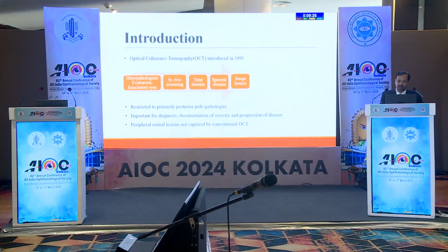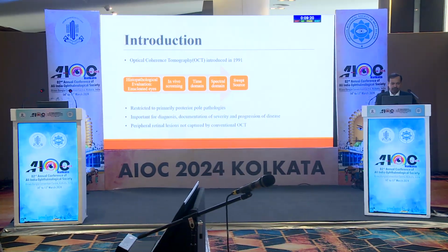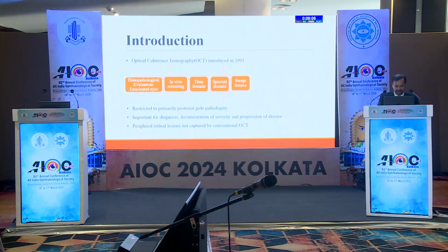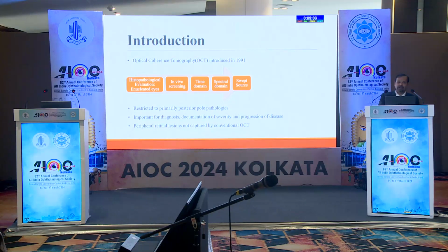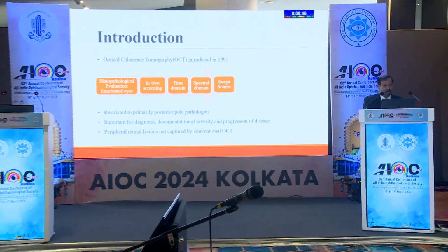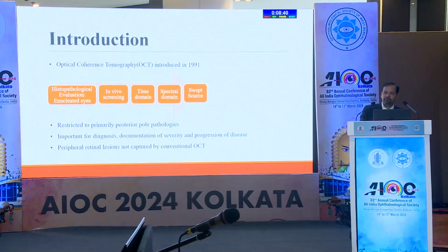I think even spectral domain OCT has undergone evolution in the sense that the scan speeds and the resolution have improved, thereby spectral domain still remains the standard and is the most commonly used OCT. Swept source has been introduced and has advantages over spectral domain in terms of higher depth of penetration. But till date, our evaluation of retina in terms of OCT has been restricted to the posterior pole or maybe a little beyond it. And we know that in today's scenario, OCT is virtually indispensable not only in retina practice but also in other forms of ophthalmology.